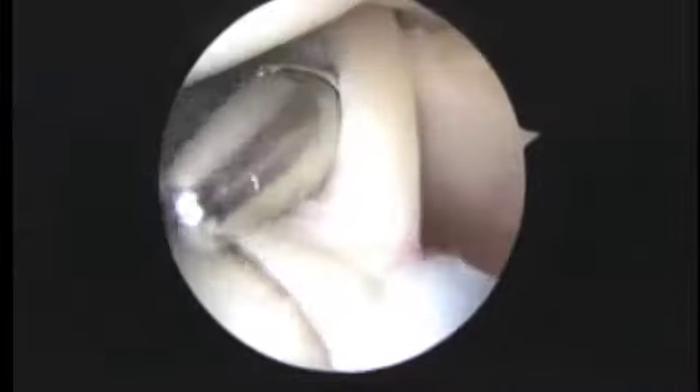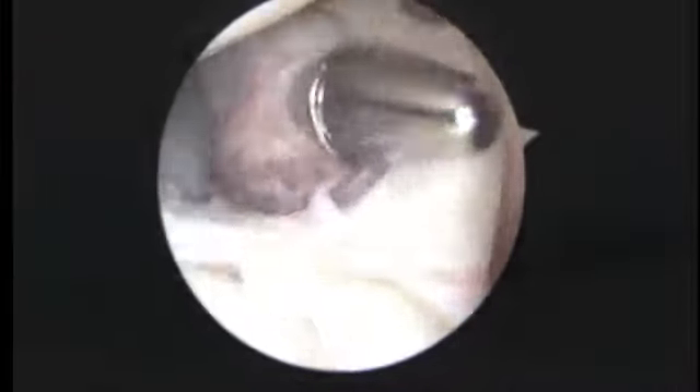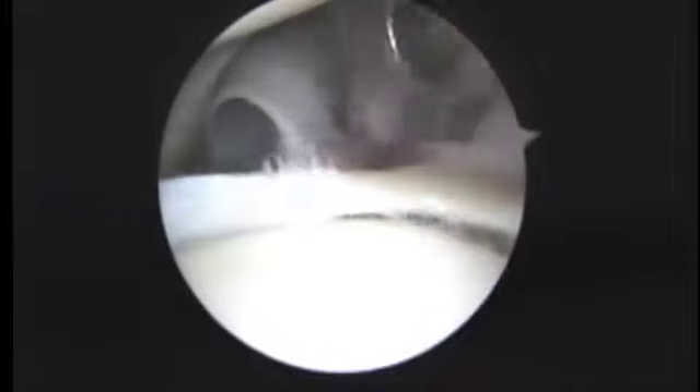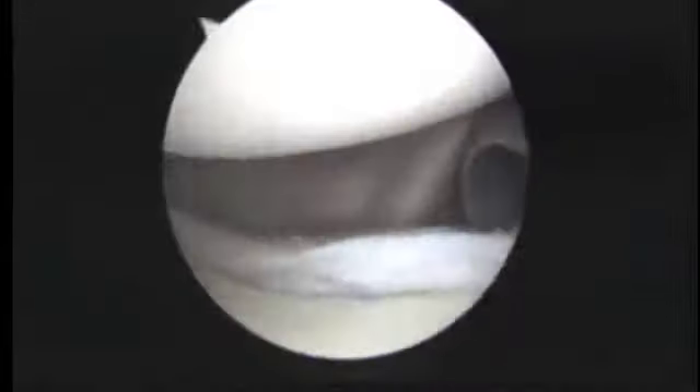We've got a plastic cannula coming in the front. You can see a metal cannula next to that, and to the right of the metal cannula is the biceps tendon. The biceps anchor is loose, so we're going to be doing a soft tissue biceps tendon repair to make sure we have that addressed.